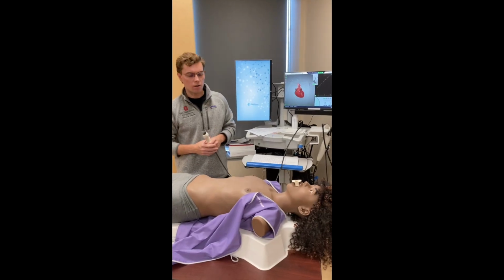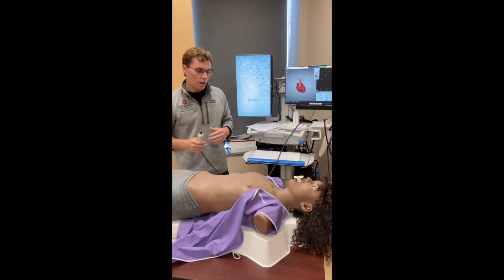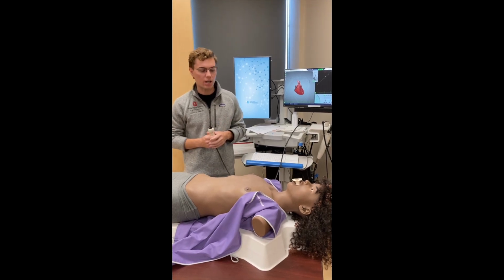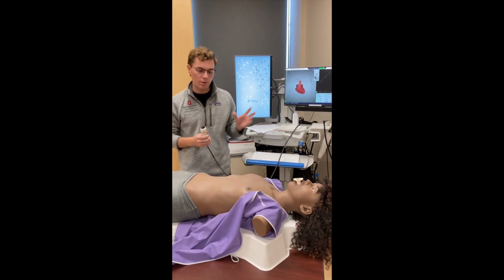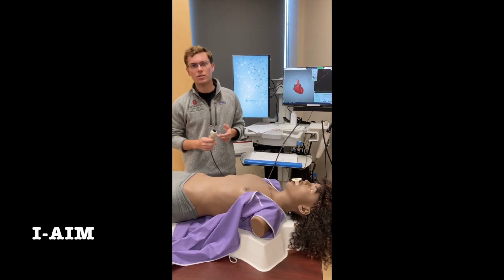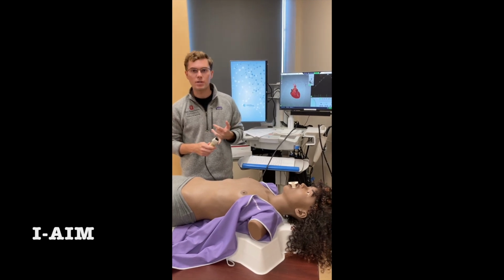For this station, like all others, the goal is to get the probe in the student's hand as quickly as possible. So we're going to be using Eve to assess cardiac physiology and then tamponade on imaging. As for any image, we use I-AIM: I is indication, A is acquisition, next I is interpretation, M is management.